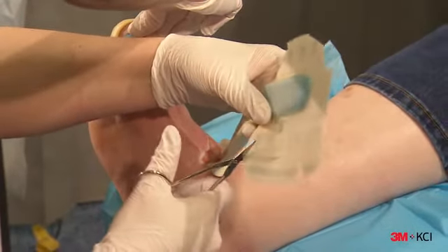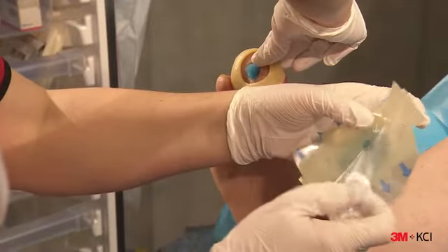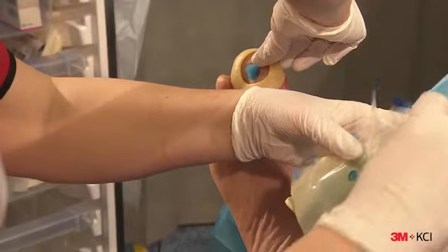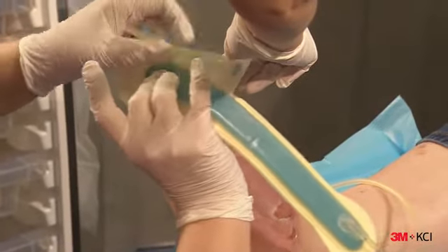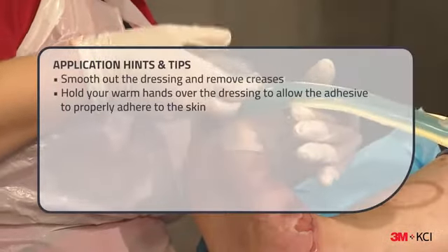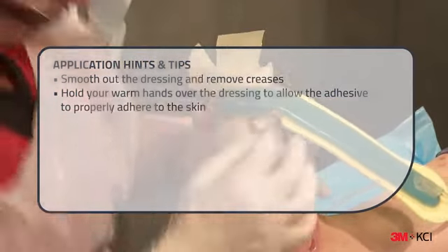To begin application of the Snap Bridge Dressing, slowly peel away the release liner as you carefully place the Snap Bridge Dressing over the wound. Ensure the centre opening of the port is placed directly over the foam interface and carefully apply the dressing over the wound. Next, remove the side release liners one at a time and carefully press the rest of the hydrocolloid dressing to the skin.